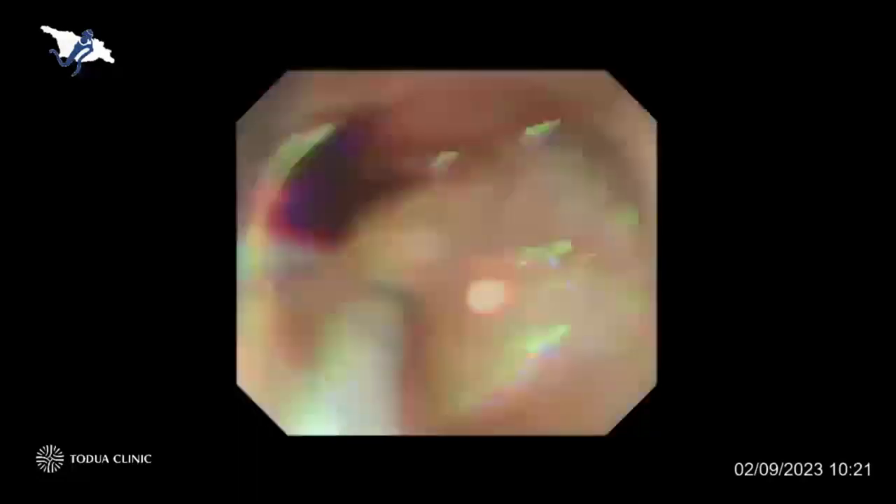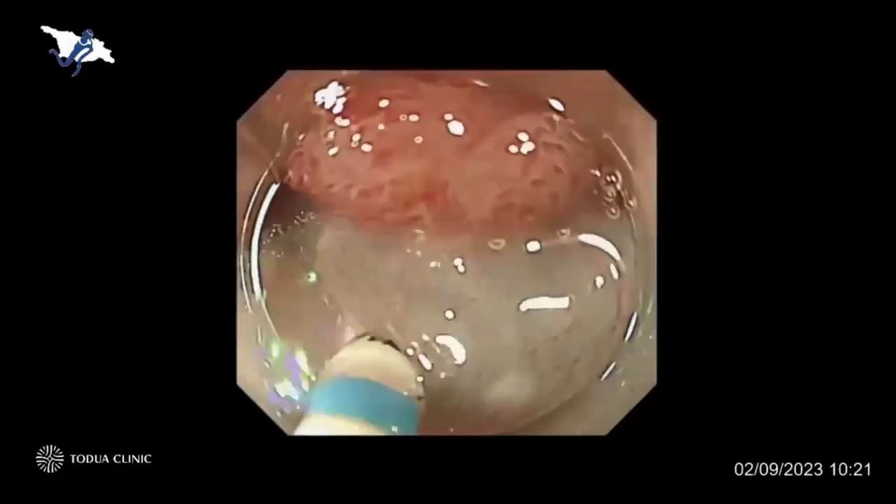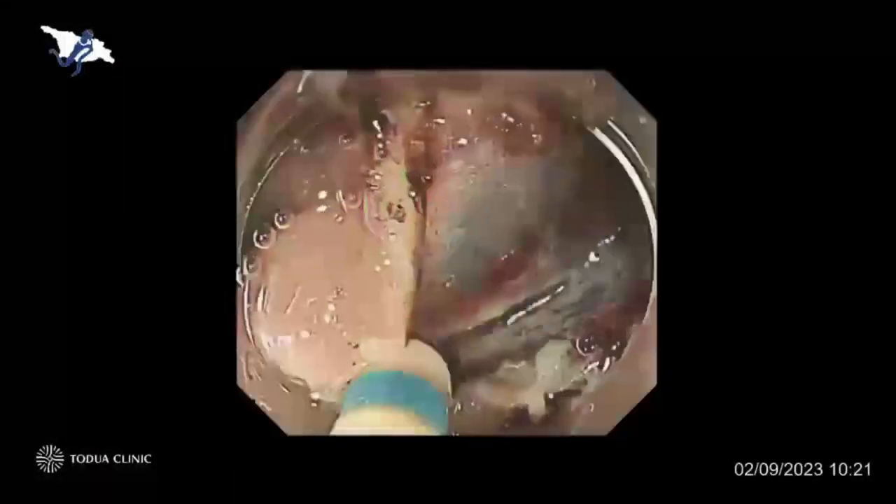That's why we usually use glycerol solution for most standard ESD procedures, and fortunately that solution is quite cheap. Now I'm injecting solution through the knife — this device has injection capability, so we can inject additional solution at any time. And for tiny blood vessels, we can easily cut through there by using swift coag.